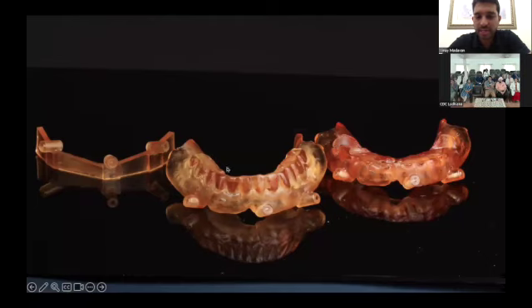So this is a denture setup. This one was an interim denture, but you can also do a tooth setup without processing it. If the patient already had an existing denture and if they don't want to go through another set of denture, you could just go ahead and do a tooth setup, put your markers, do a CT scan with it, and pretty much do the same.